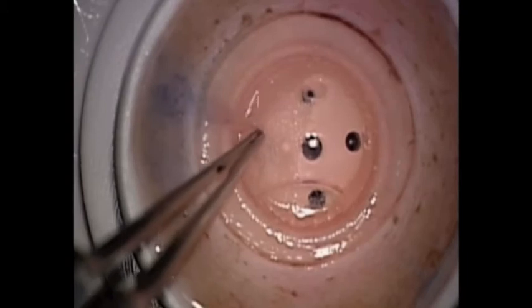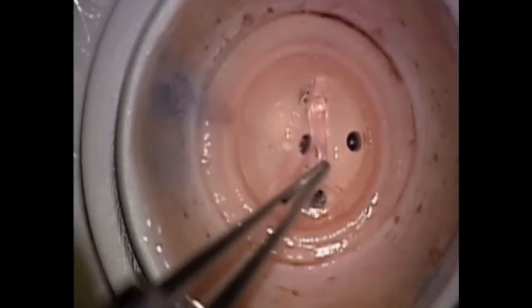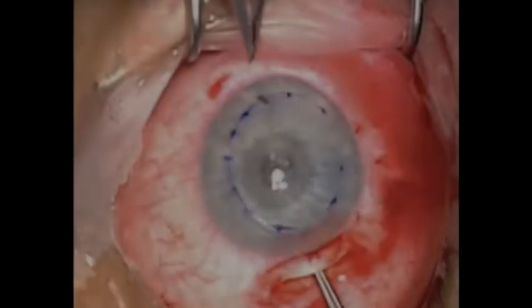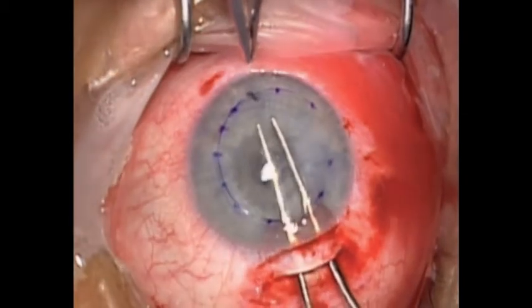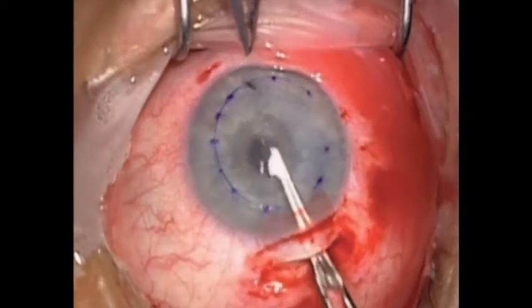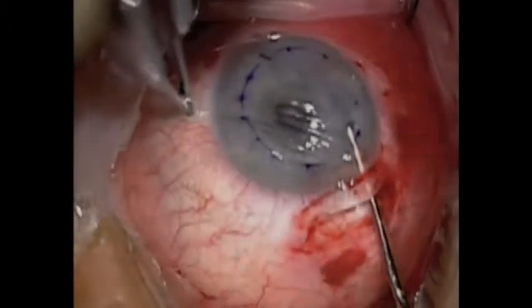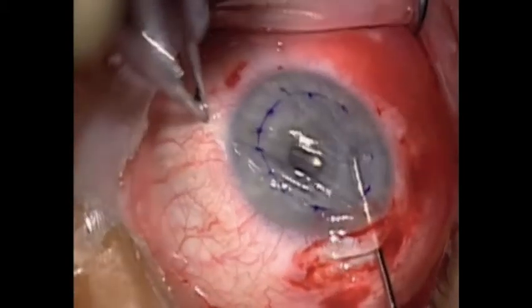In our DMEK technique, a pre-dissected donor cornea is obtained from the eye bank, and the donor Descemet membrane is prepared to the appropriate size using a standard disposable trephine. The host cornea is prepared in a standard DSEK technique by scoring and stripping the pathologic Descemet membrane, followed by scraping of the peripheral 2 mm of the host bed using a Terry scraper in order to promote graft adherence.